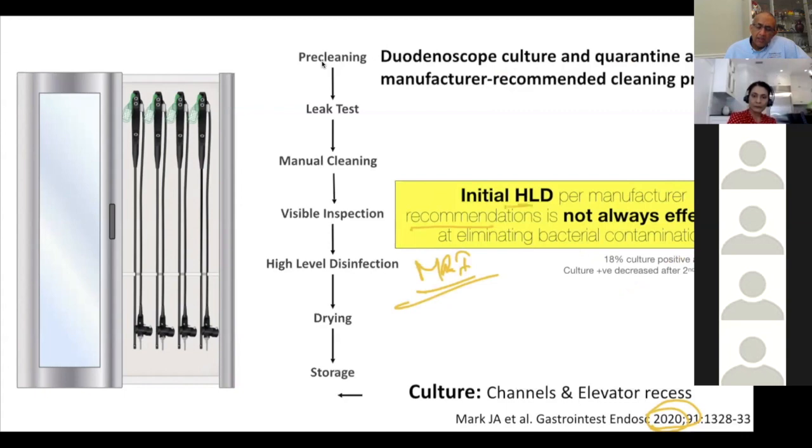So the initial high-level disinfection is not always effective at eliminating bacterial contamination. They saw in their study that 18% were culture positive after the first HLD, but it kept on decreasing after repeated HLDs. But this is something to keep in mind and figure out how we minimize or avoid this problem.